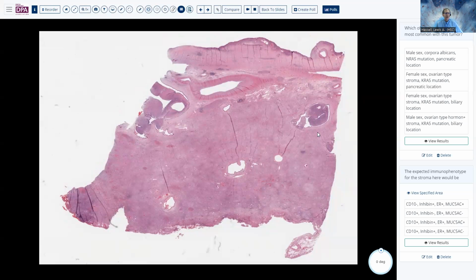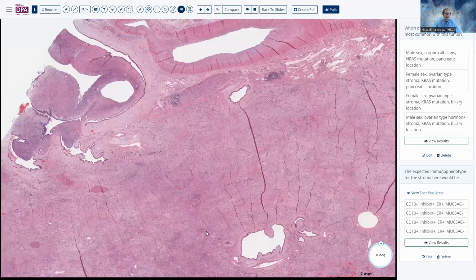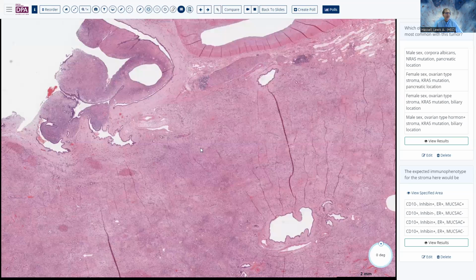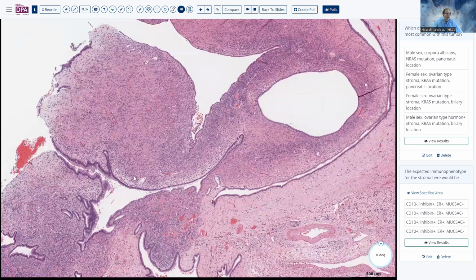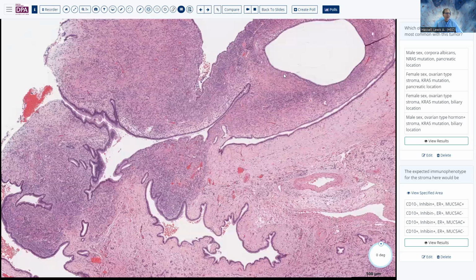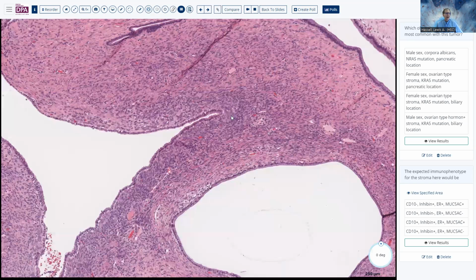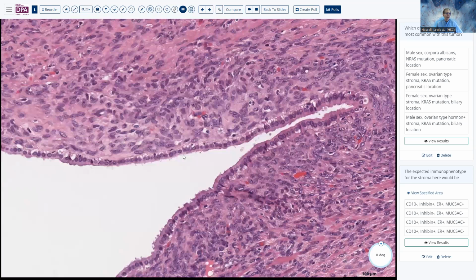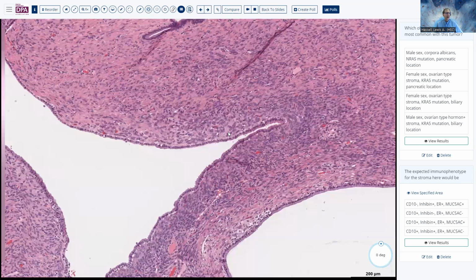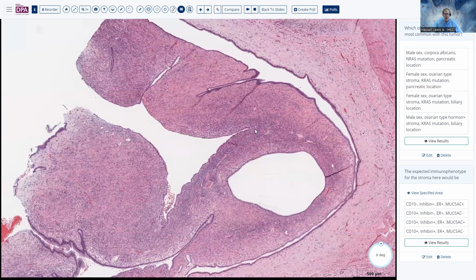Another lesion which we don't necessarily think of in the biliary tract is what we illustrate here. Now, this is a cirrhotic transplanted liver, and an incidental finding. The patient was found to have dilated biliary tract ducts with this intraluminal proliferation, as you see here. And as you can see, the epithelium is quite bland, basal nuclei, sparse amount of cytoplasm, somewhat mucinous, and so looks very banal. But we've got some funky little stromal process going along here as well.